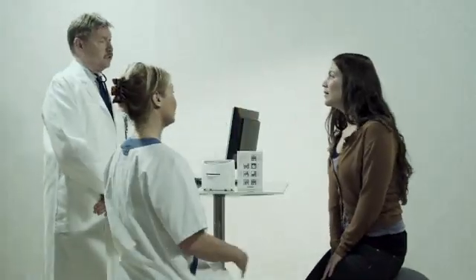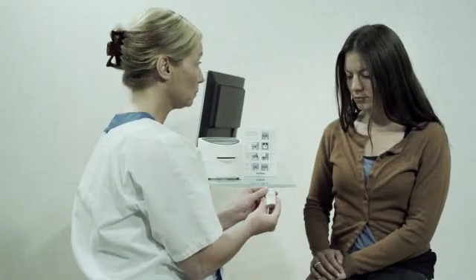Before testing, go through the test procedure with your patient. Make sure he or she has fasted for at least 4 to 6 hours and is not on antibiotics or acid-suppressant therapy.